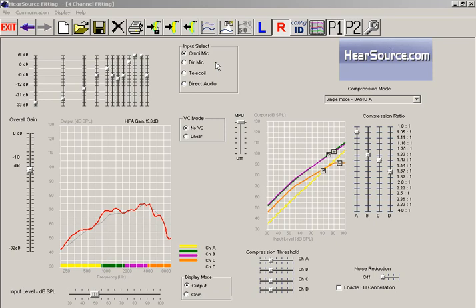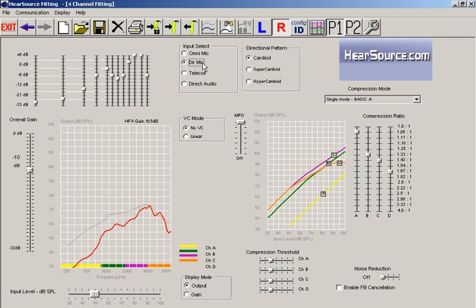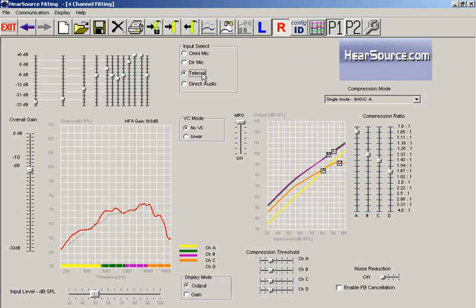We have the Omni microphone, we have directional microphone, we have the telecoil, sometimes referred to as either telephone mode or T-coil, and then we also have the direct audio option.